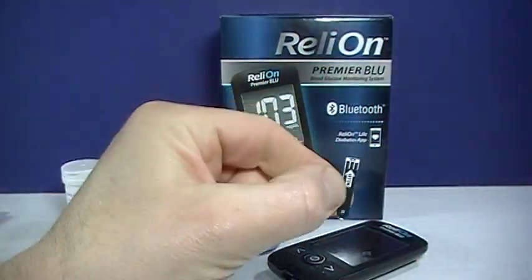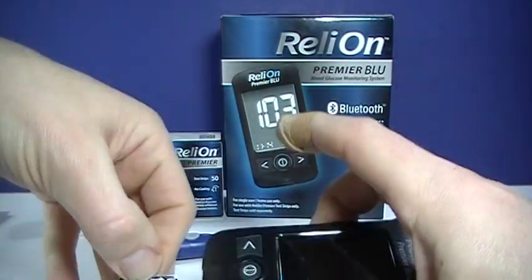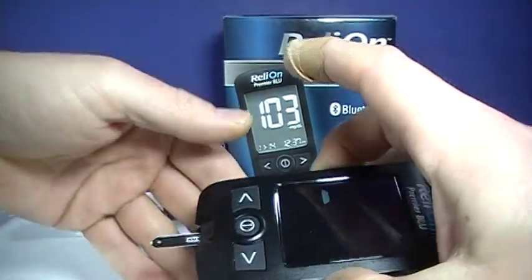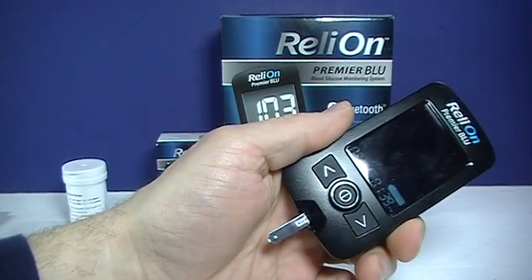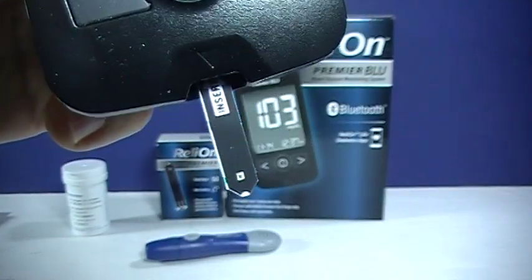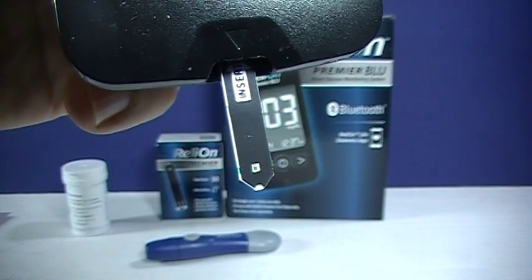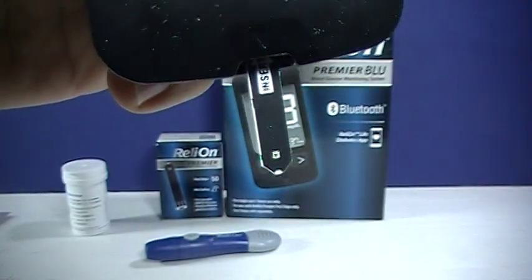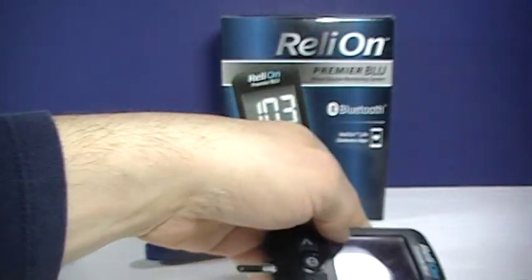The test strips are nice — it shows where you insert it in the meter. Just as the test strip indicates. It's prompting us for blood. You can see the test strip there. You touch the very bottom of the test strip to the blood, and that little square window should turn red. That helps indicate that you've got a proper amount of blood on that test strip.